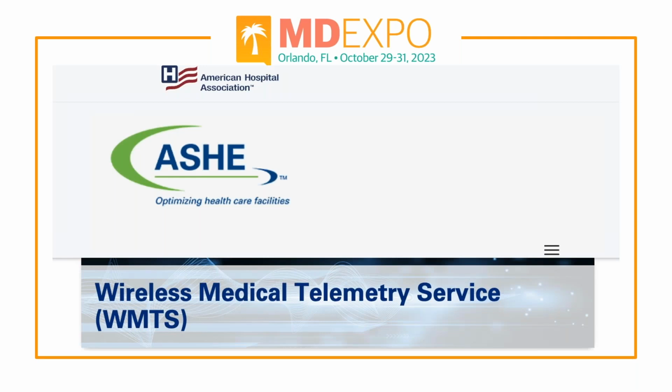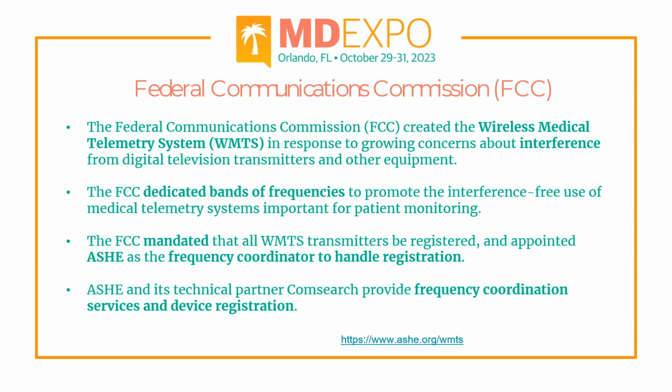This is the link here, and basically, as I mentioned, they created this WMTS, the Wireless Medical Telemetry Service, in response to growing concern about interference. So what happened when digital televisions were introduced? Other equipment started having interference in the particular bands they were operating in.